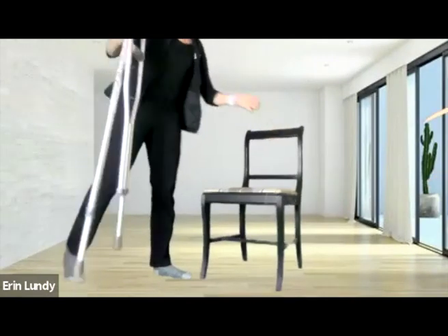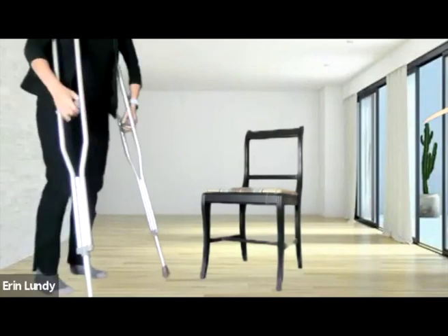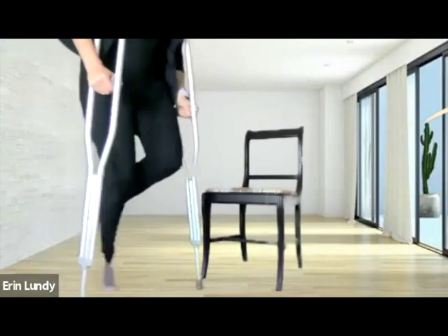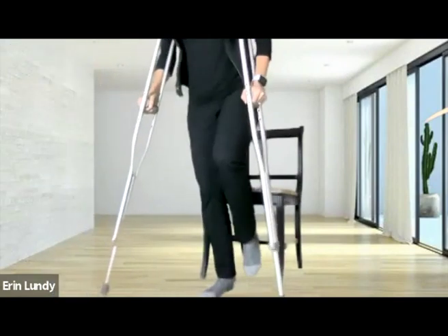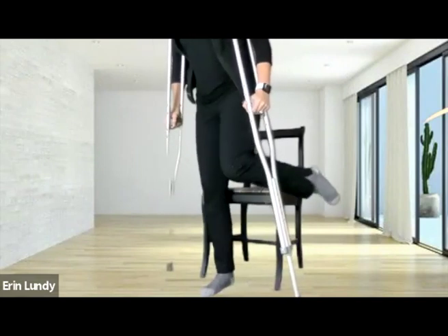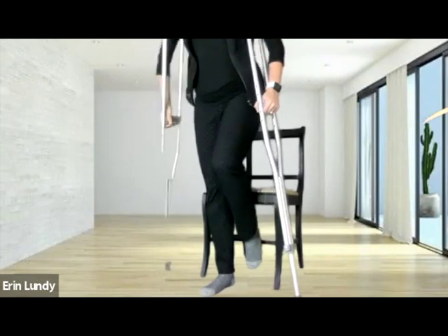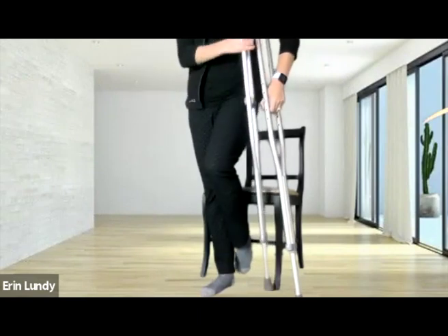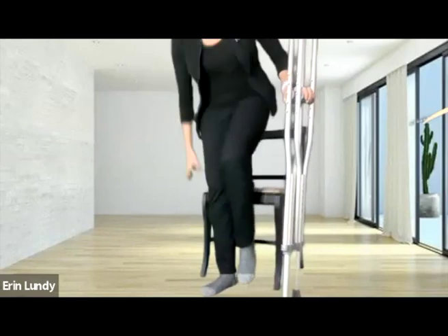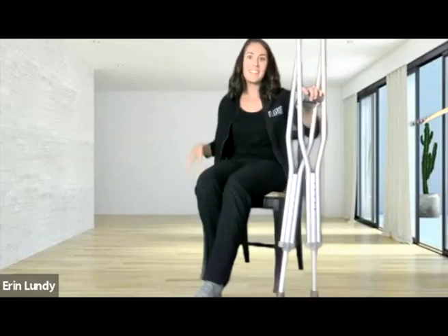So when you're approaching your chair, let's say that my left leg is the injured leg. You're going to come up to the chair and face with your body backing up, and you can actually feel the chair with your non-injured leg. So I can feel this. Then I'm going to move my crutches over to my injured side. Okay. I'm going to grab onto these hand grips right here and sit myself on back, kicking my leg out. Pretty simple, right? A lot of times I'll see kids will try to swing up or swing back, not safe.